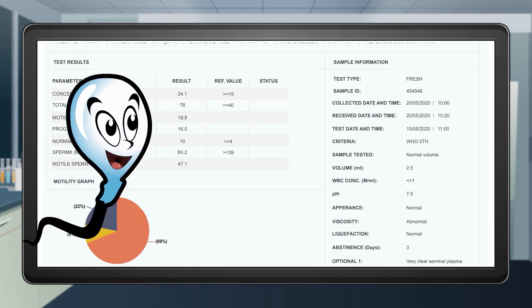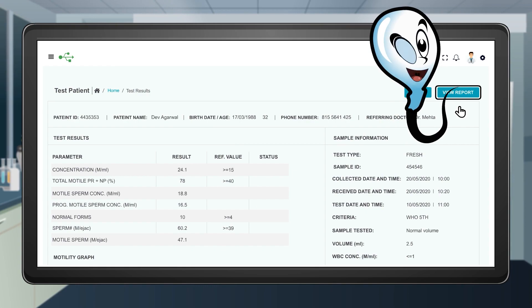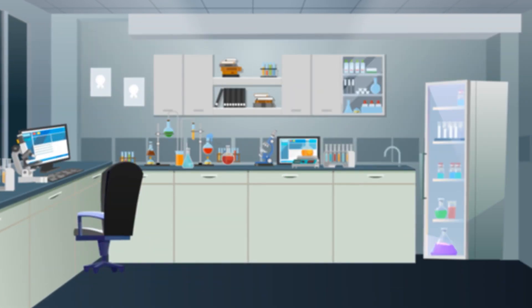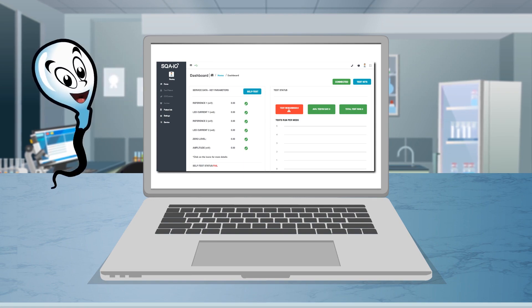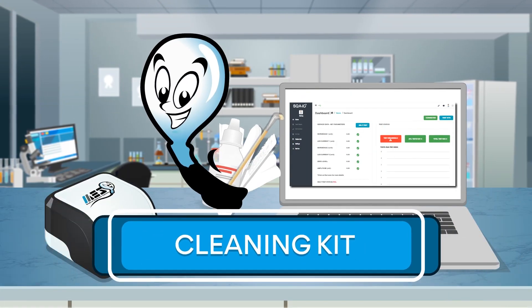After 75 seconds, your test results are displayed. You can print a report, send the results to your primary data management system, and archive the results for future reference. To meet regulatory requirements, the SQAIO has modes for quality control and proficiency testing. Key service parameters are monitored from the home screen, and daily maintenance is a breeze with the included cleaning kit.